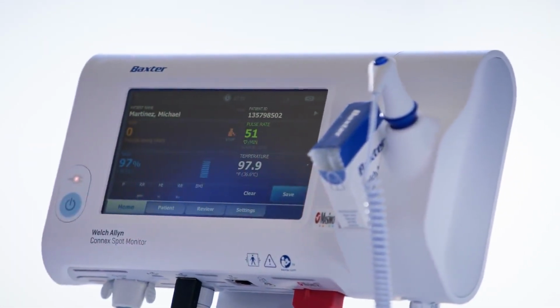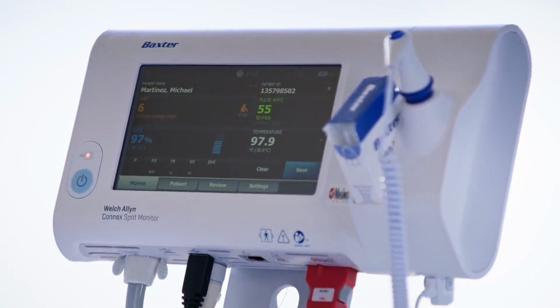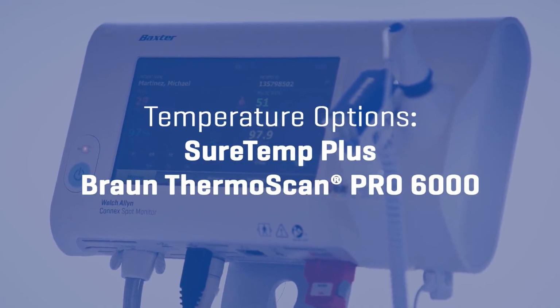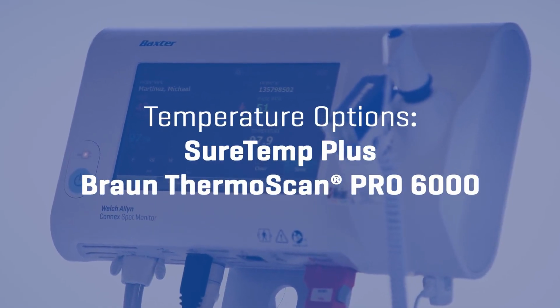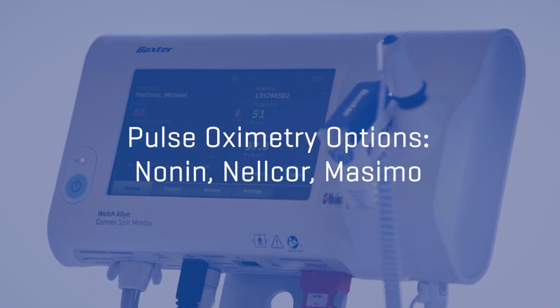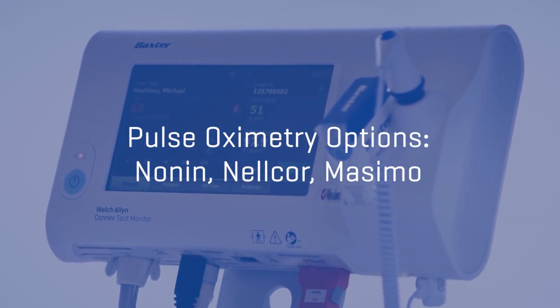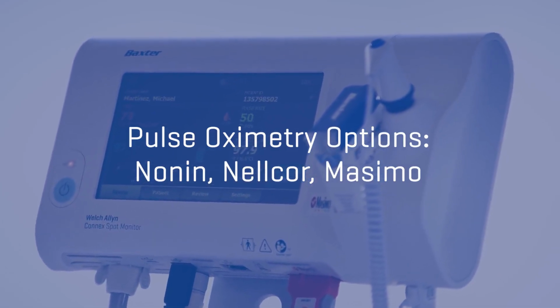Temperature options include oral, axillary, and rectal with the Welch Allyn SureTemp Plus, or tympanic with the Braun Pro 6000. Pulse oximetry can be configured to accept sensors from either Nonin, Nellcor, or Masimo.